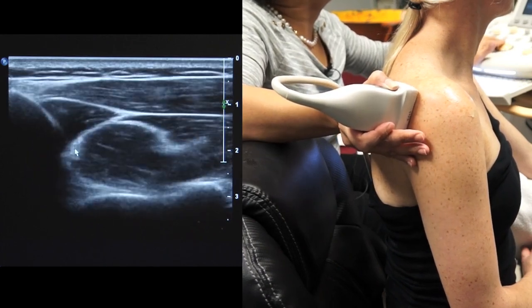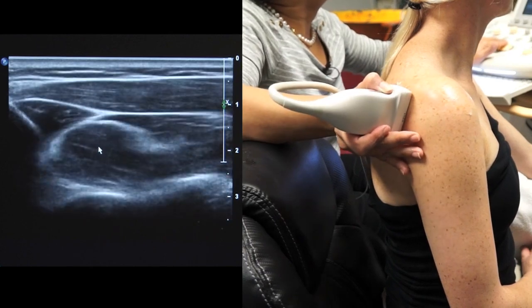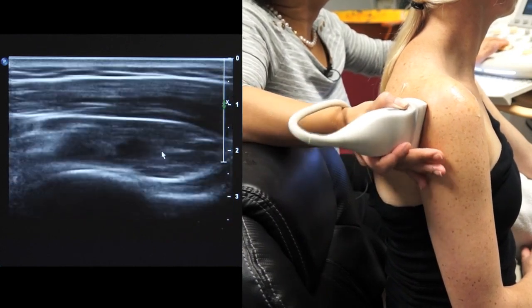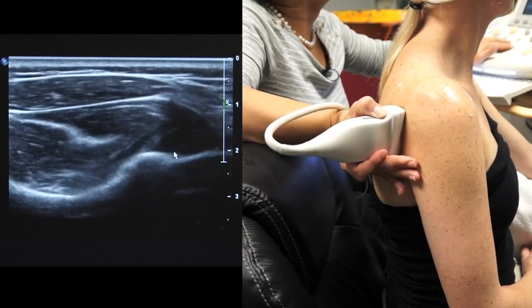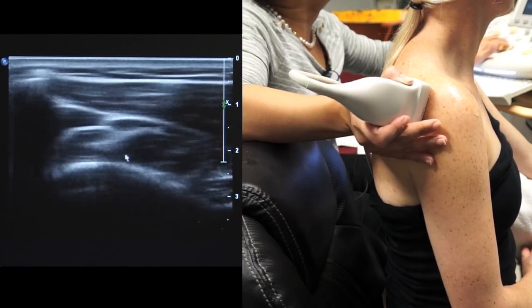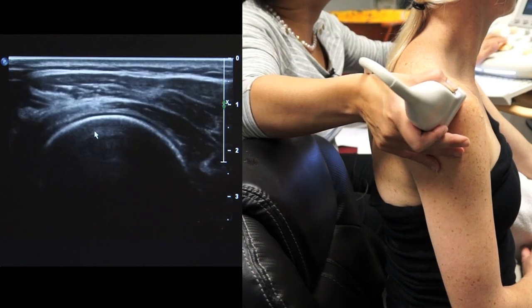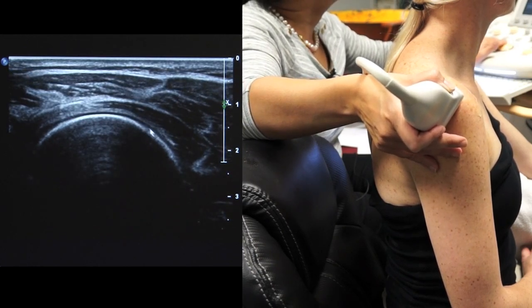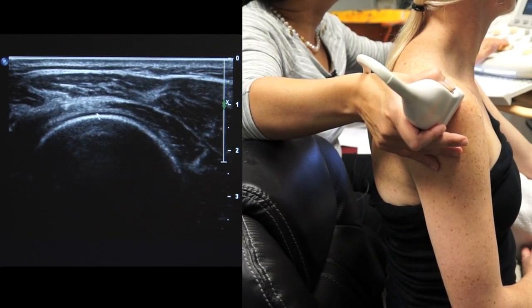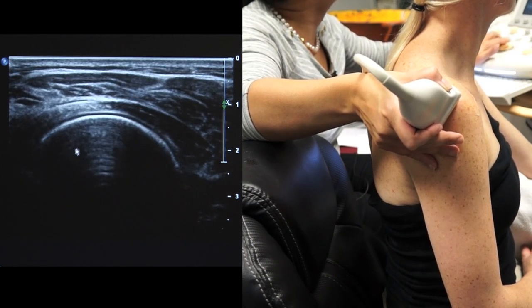And you can see on the screen that the muscle fibers will converge together, both the infra and the teres, which are inseparable on this scan. We can see them converging together to form the tendon as it goes towards its insertion. And here is the humeral head. Again, looking at the hyaline cartilage on the humeral head, we have a nice smooth surface.